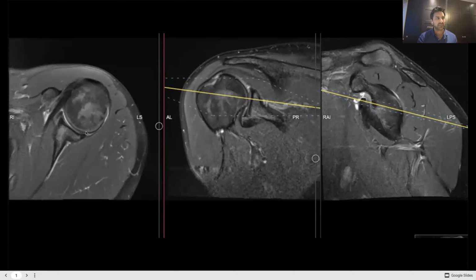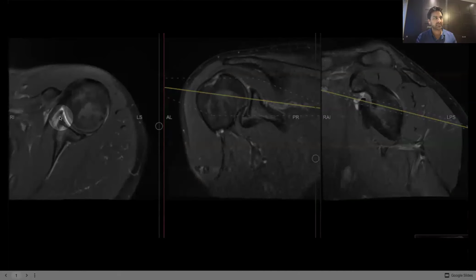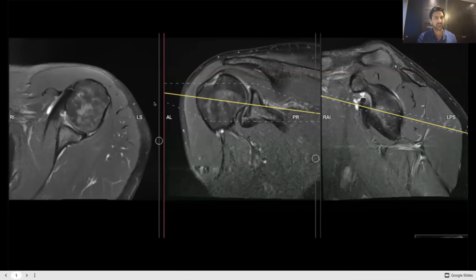The bone is gone. And also, can you see the little cartilage cap, like a suction cup, sitting over there in this area? Sorry, let's come back here. You see that over here, but as you come down, it completely disappears. So this person has got a significant injury.